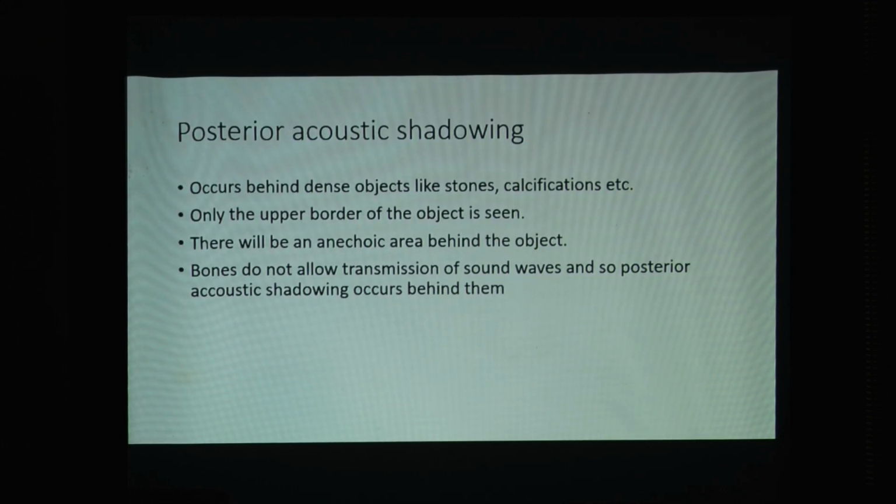Posterior acoustic shadowing happens behind dense objects. This actually helps us to identify the tip of the needle also. See, there will be a shadowing behind the tip. So for FNAC and all, we can identify the tip by the posterior acoustic shadowing.